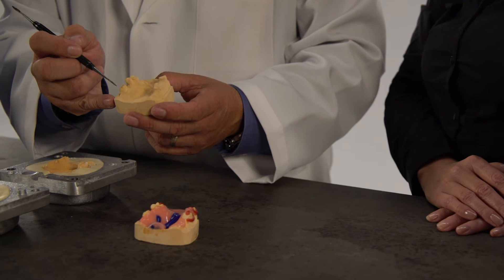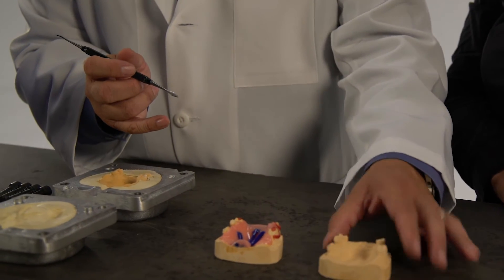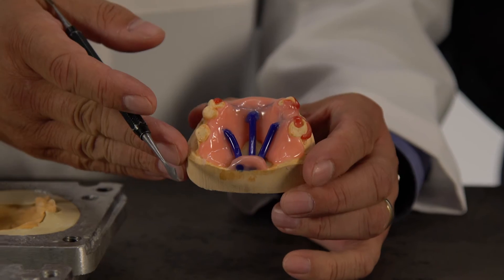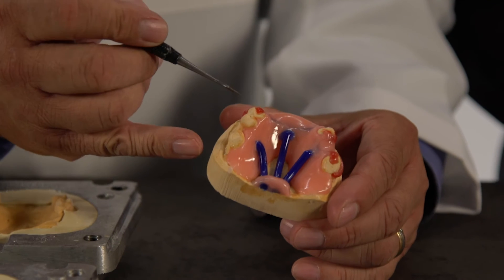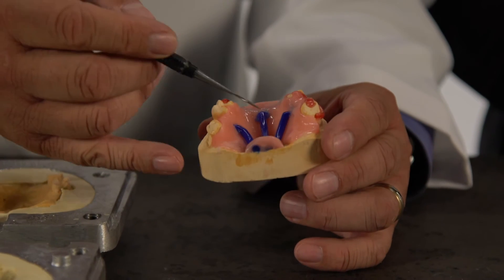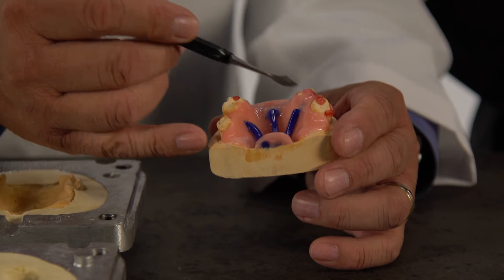First block out the undercuts for the correct path of insertion and add spacing wax on the saddle areas so there's room for acrylic to flow in the ridge areas. Next step, wax the framework with clasps, rests, major, and minor connectors.